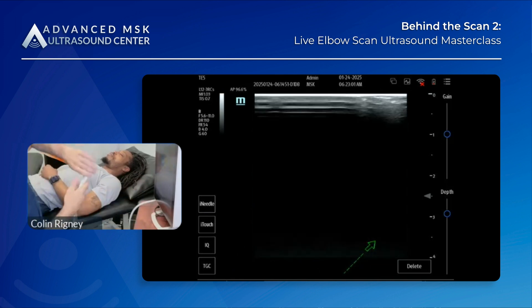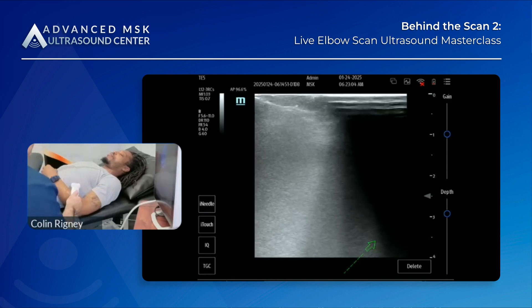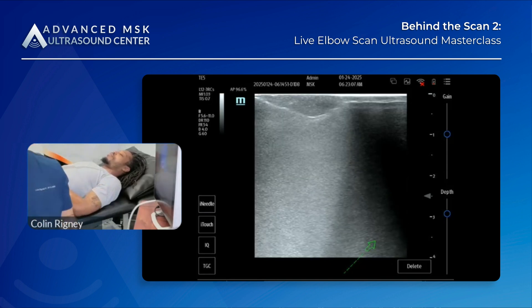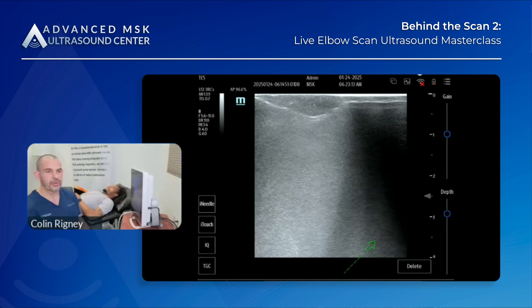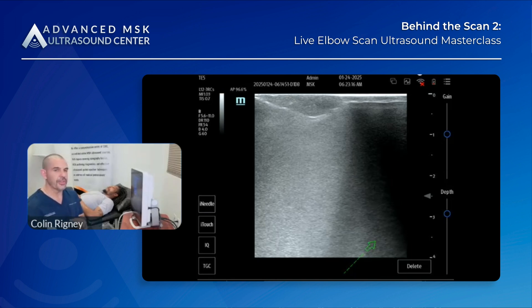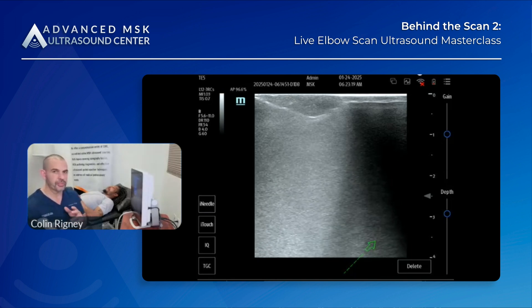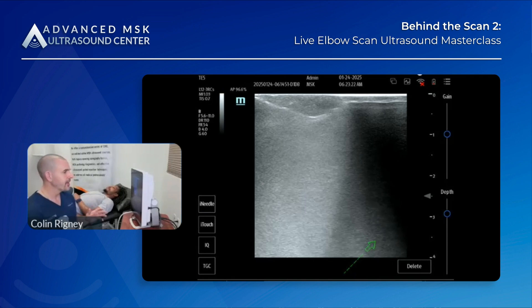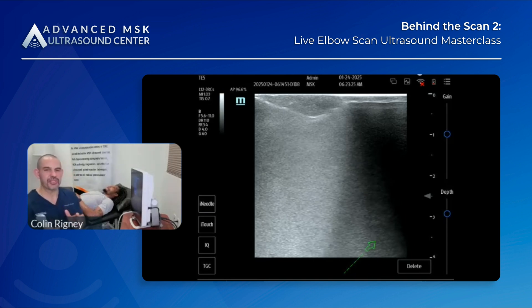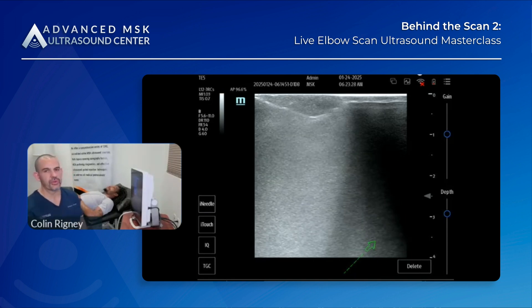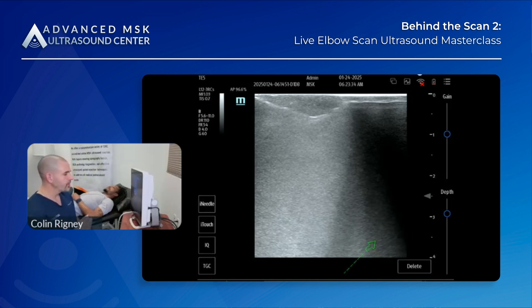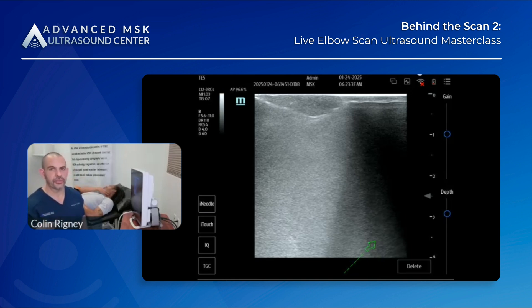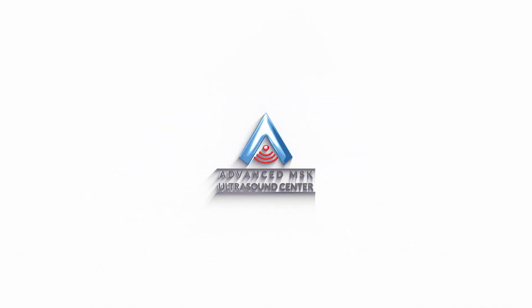The medial and lateral windows are really nice dynamic confirmations of the bicep brachii and how intact it is. The anterior window is probably your optimal view for tendon-bone footprint, with the medial a close second. The posterior window is the window you'll use if you're a physician doing orthobiologics or PRP injections — that's the window you'll use to guide your needle to the distal bicep insertion.